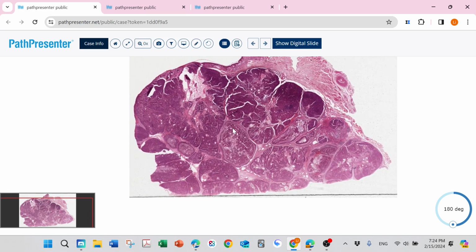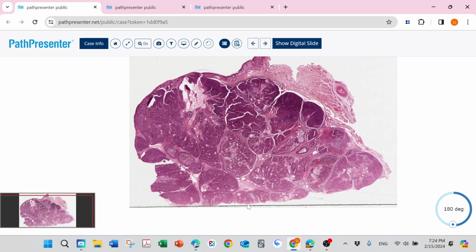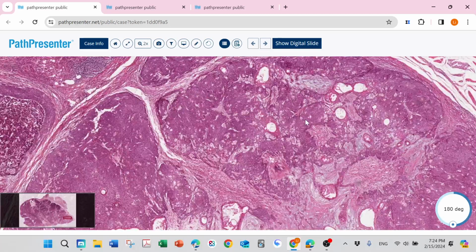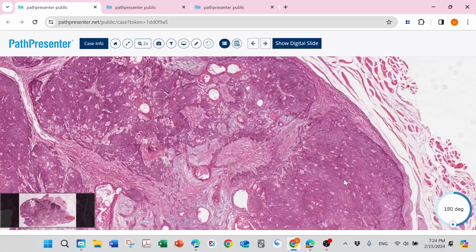Then we have this sebaceous carcinoma. This lesion is really big. Even in this part, we can see the lesion kind of dissected. So you can estimate this is a really infiltrative lesion, really dark, really hypercellular, hyperchromatic. And in some areas we can still see this sebaceous differentiation.